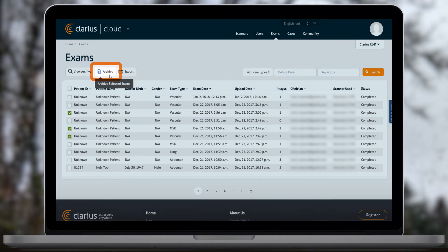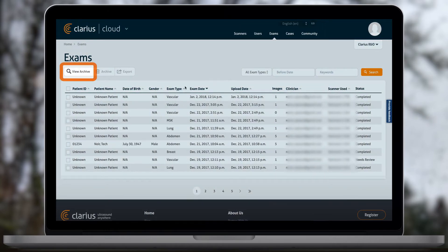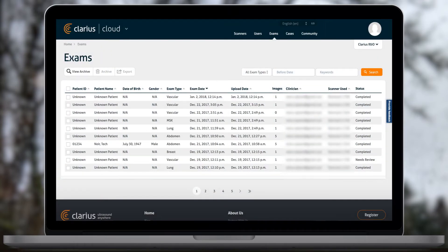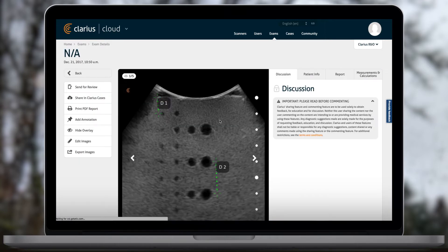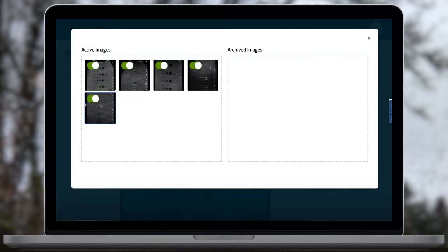These exams will not be deleted and you can recover them at any time from your archived exams page. You can also archive specific images within an exam by clicking Edit Images. Drag images between the active images and archived images columns to choose whether they will be displayed in the exam.